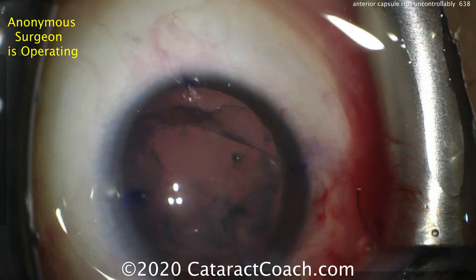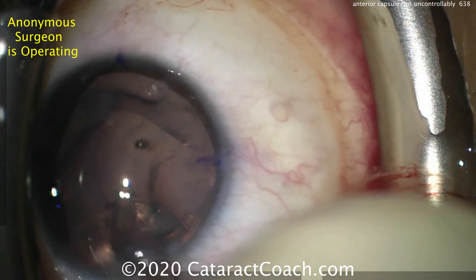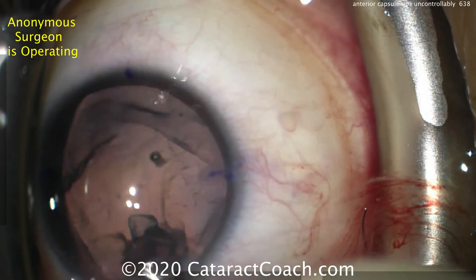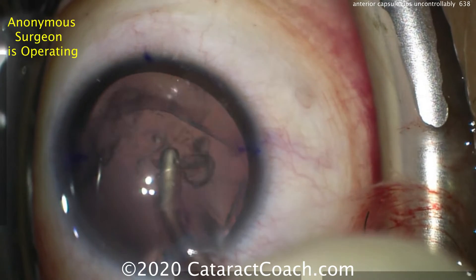Is the capsular support going to be sufficient to hold and securely position that toric IOL? Switching over to the IA probe and removing the lens cortex, now you can see what's remaining of the anterior lens capsule. Fortunately, the posterior capsule is still completely intact.